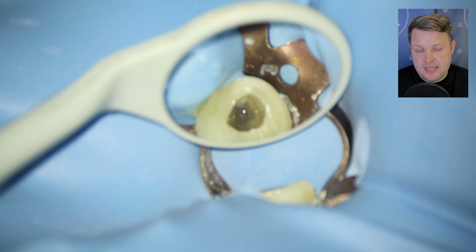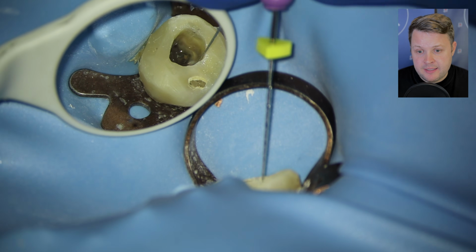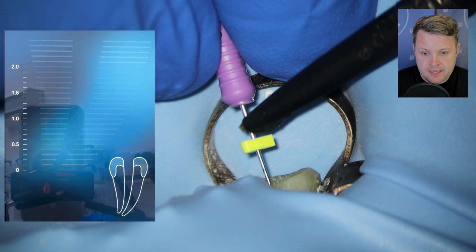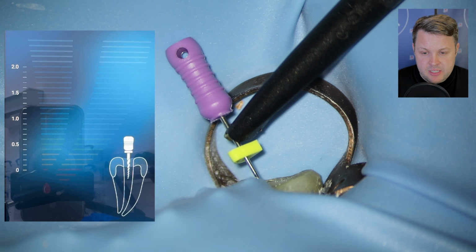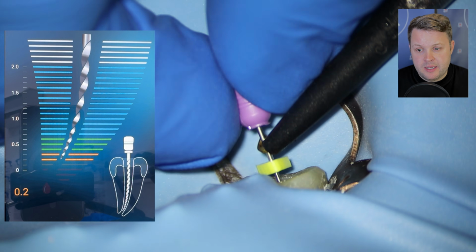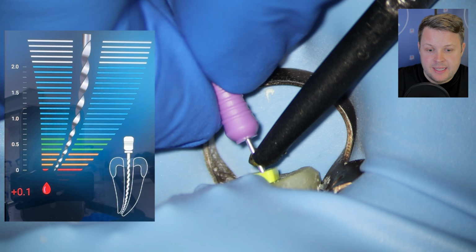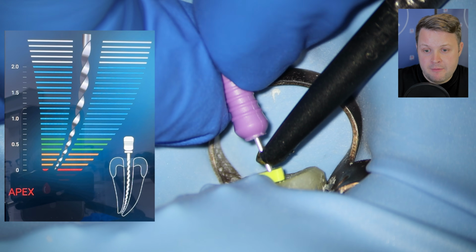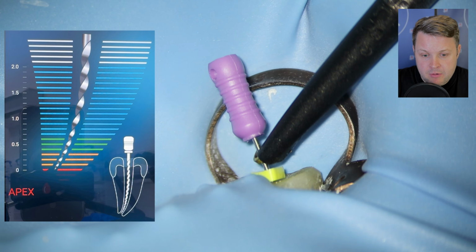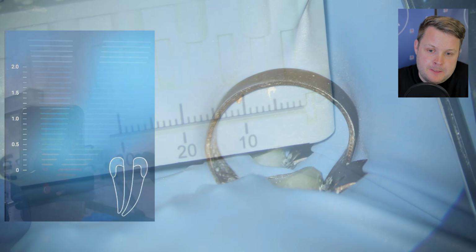Like I said, this size 20 and 25 has gone really nicely to length. We get our size 10 D-finder, hook this up to the apex locator, and we're right at the end there. And obviously the obturation in this tooth is really poor. So essentially what this file is doing is just bypassing the obturation, and we're getting a nice zero reading. Again, we're going to push the hand file out, back it up, and this is our zero reading, and that is 19.5 millimeters.